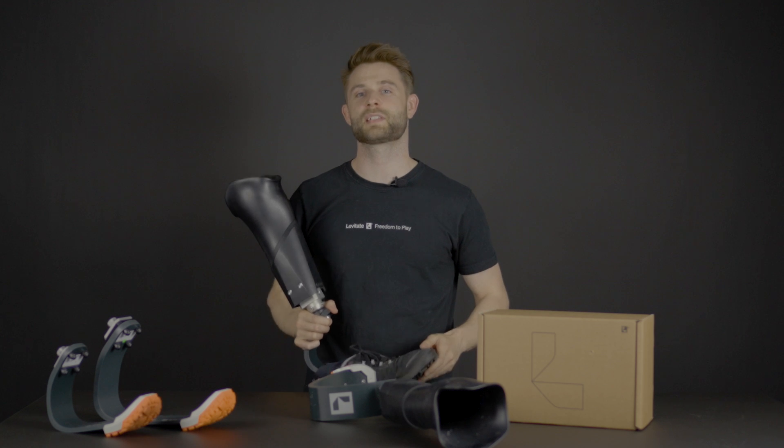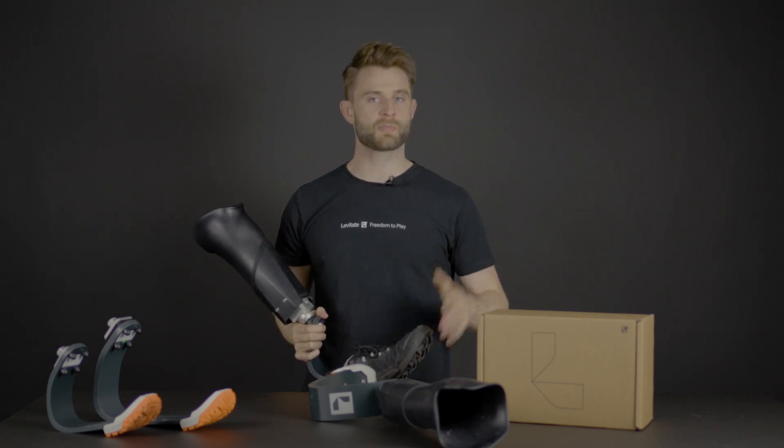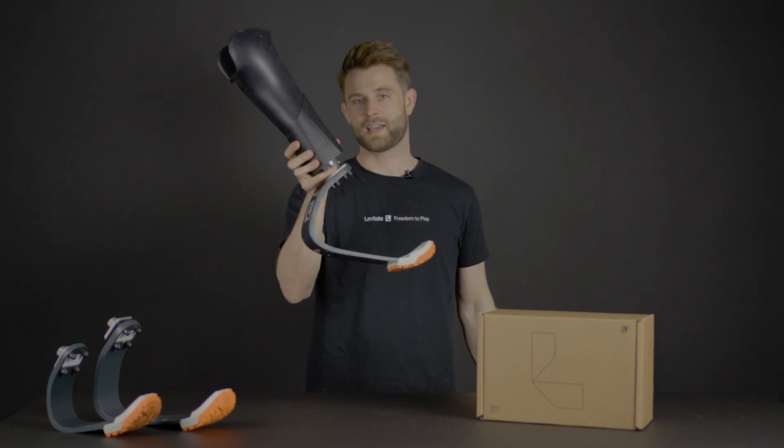Today you probably have a leg that looks something like this. What we are doing in Levitate is that we've assembled everything you need in this box to turn your walking leg into a running leg.